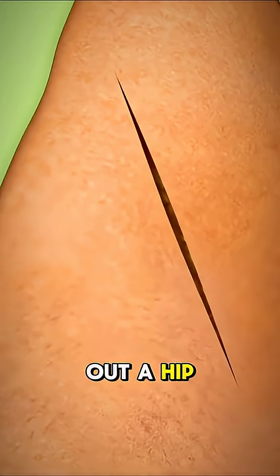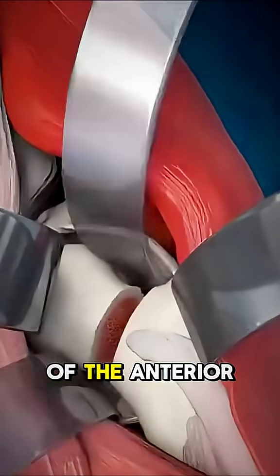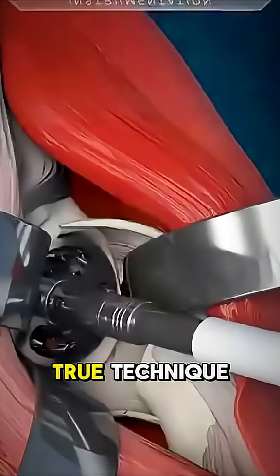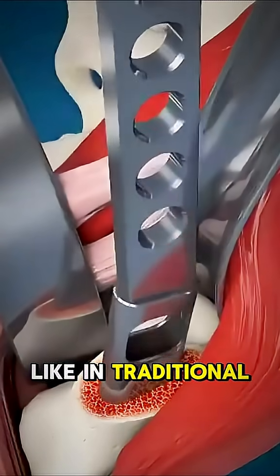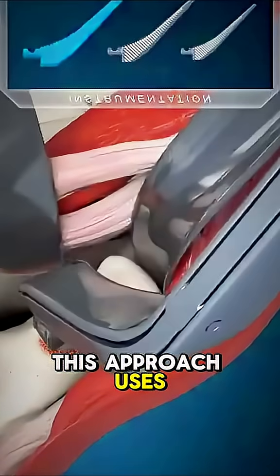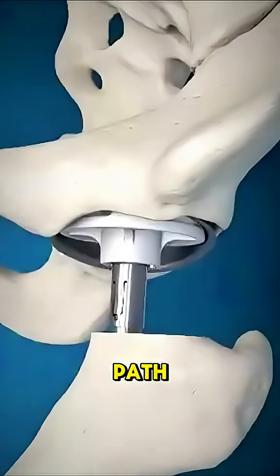Ever wondered how surgeons can swap out a hip joint without slicing through major muscles? That's the magic of the anterior hip replacement technique. Instead of going in from the side or back like in traditional surgeries, this approach uses an incision at the front of the hip, where fewer large muscles block the path.